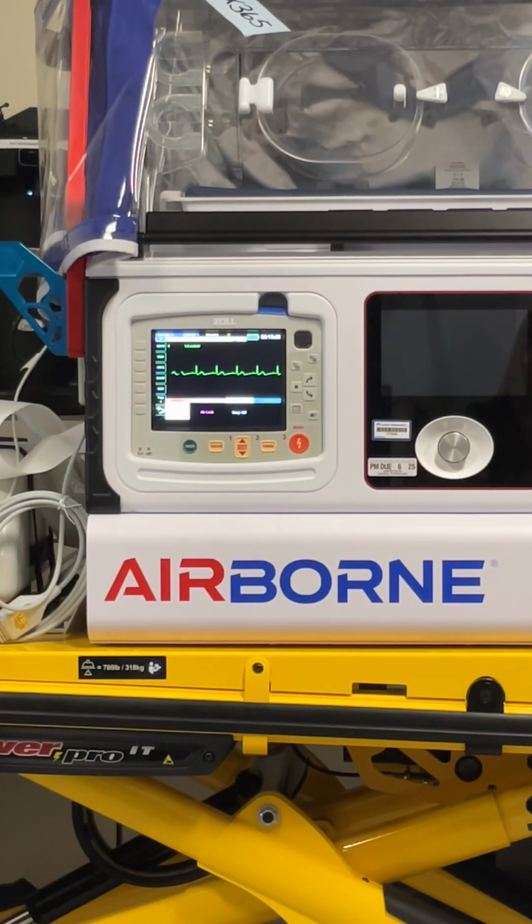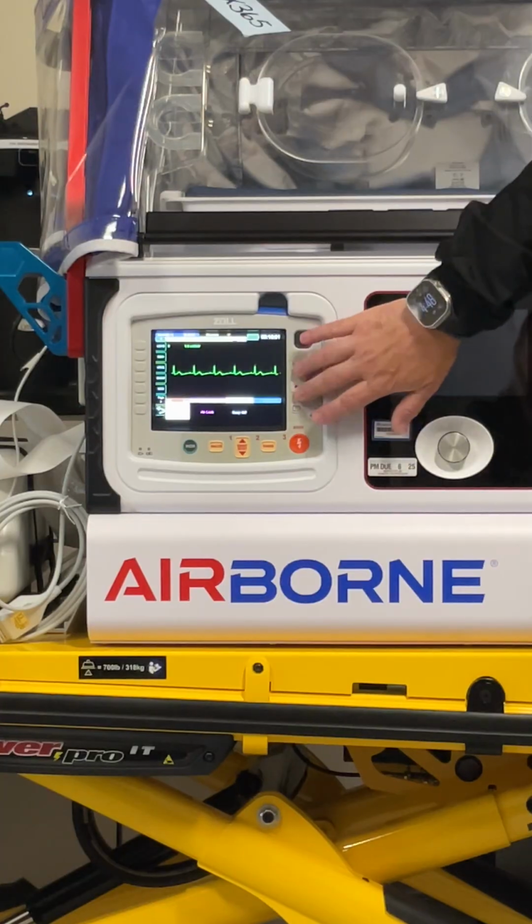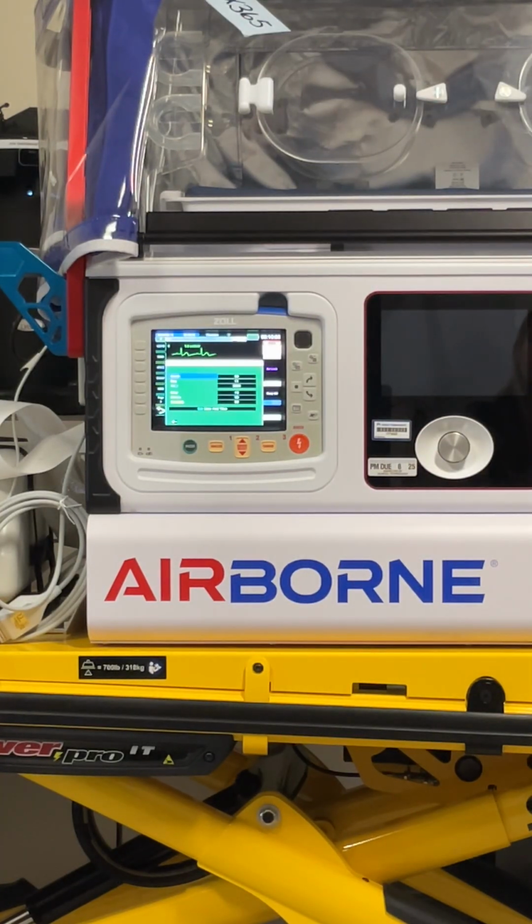The bottom button was respiratory change. If you make a vent change, a cannula change, or a CPAP change and don't have time to chart it, you can click it. To change your time, you just highlight the date and time and you can change it. Just remember to hit save date and time.